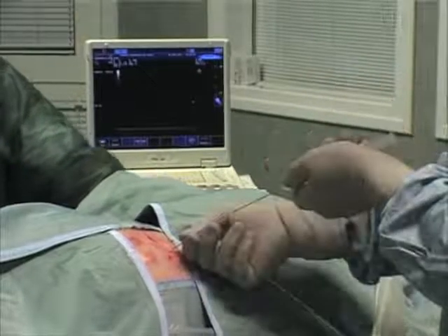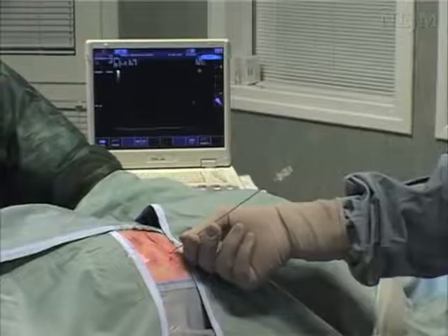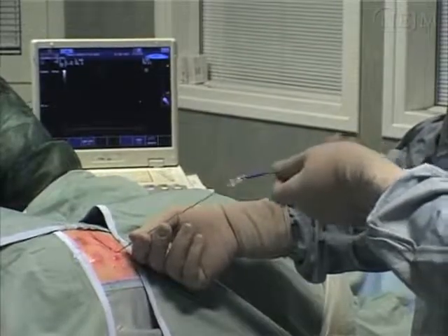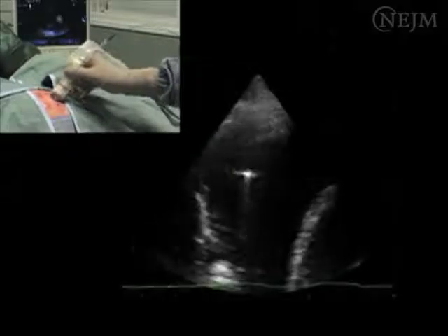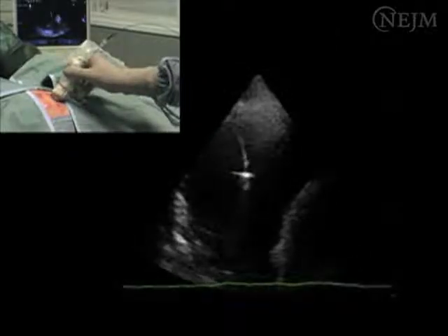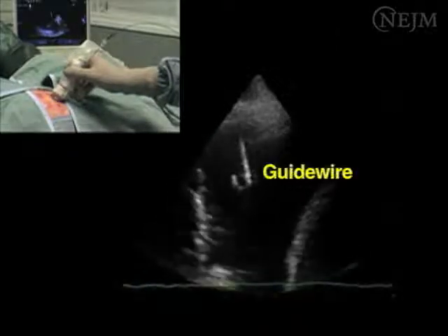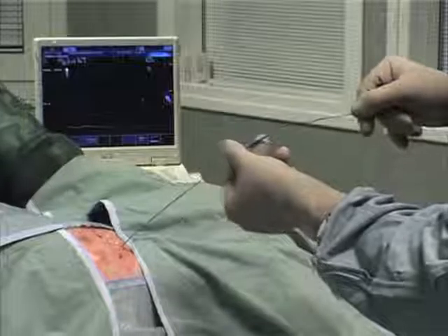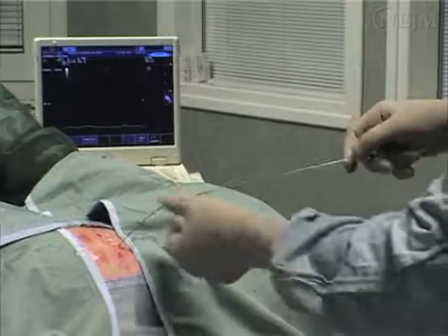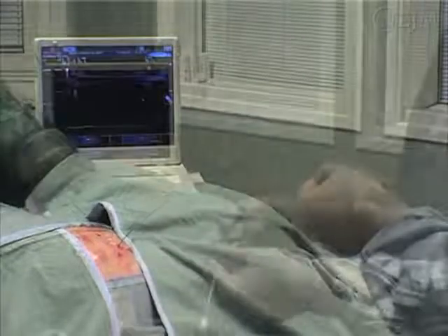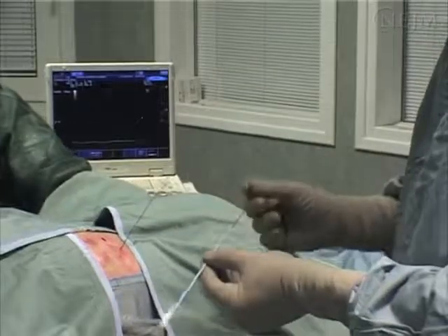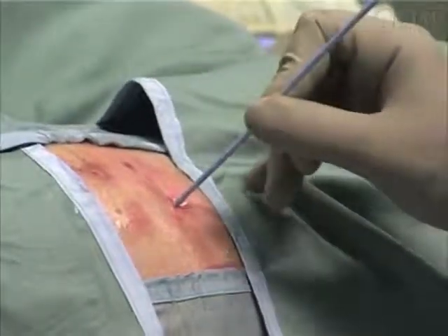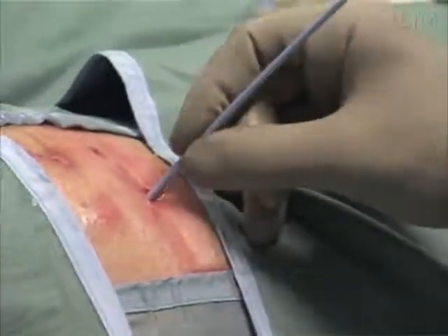Confirm the penetration of the needle into the pleural space by aspirating pleural fluid into the syringe. Once you have reached the pleural space, disconnect the syringe and slide the guide wire through the needle into the pleural space. Confirm the intrapleural location of the wire as you visualize it with the ultrasound unit. Remove the needle and advance the dilator over the wire by its half through the skin and parietal structures. Push the dilator firmly but gently against the skin, twisting it as it advances.